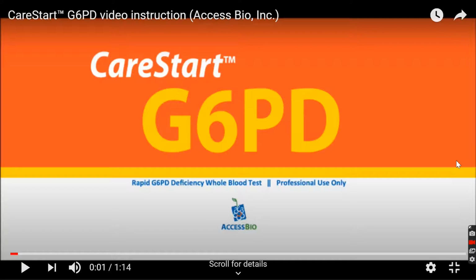I will now demonstrate to you the use of the rapid diagnostic test to diagnose G6PD deficiency from Carestart, which you will have received. The test is a lateral flow assay that provides a result within 10 minutes. There are a number of limitations to the test.